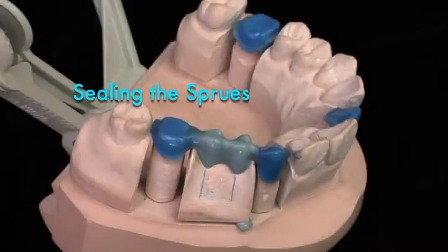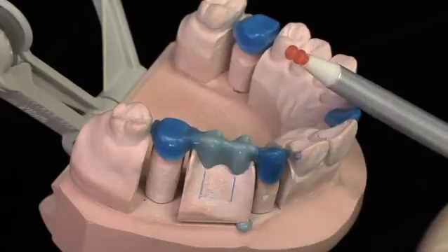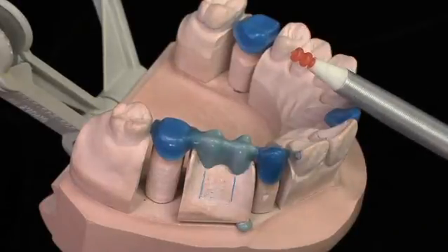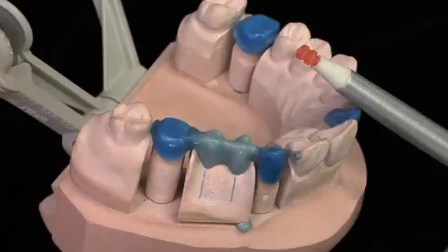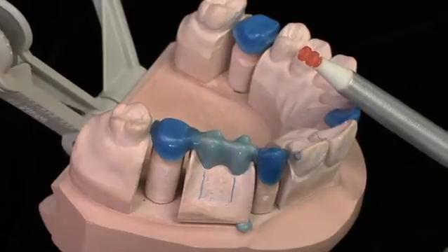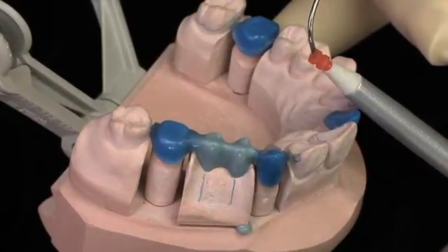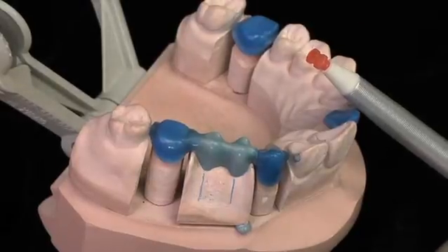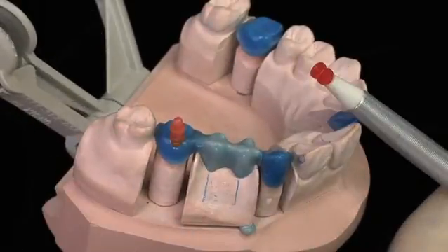I want to show you how to accomplish the sprueing for this four-unit wax framework pattern. I've mounted a quick sprue in the quick sprue instrument. The quick sprue is made of sticky wax. All I have to do is soften it and attach it. I've set my spatula temperature at the optimum temperature for sprueing. For the pontic, I'll be using heavier sprues — this is a red quick sprue and it's equal to a six-gauge round sprue.